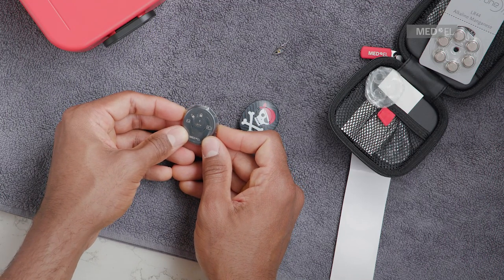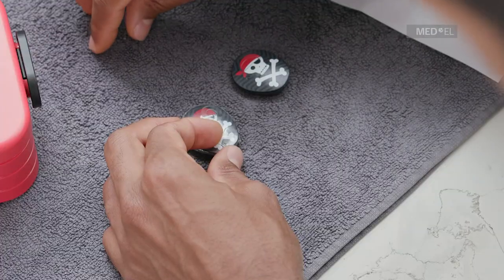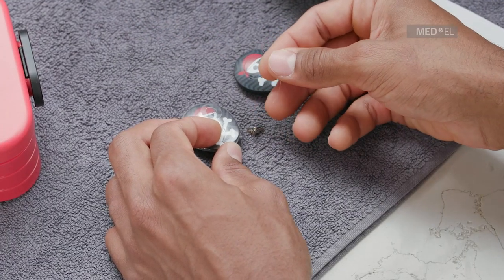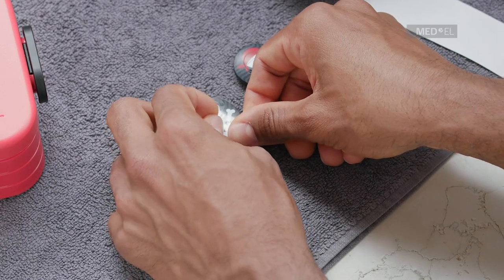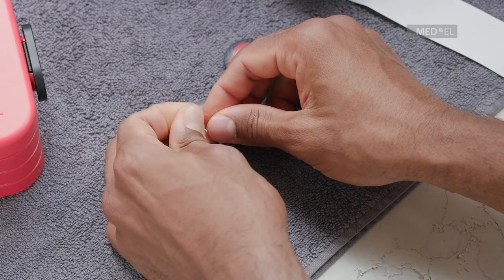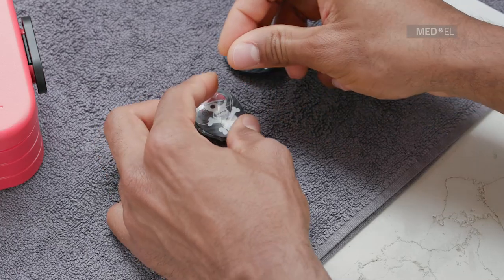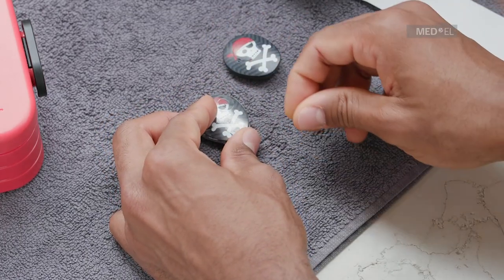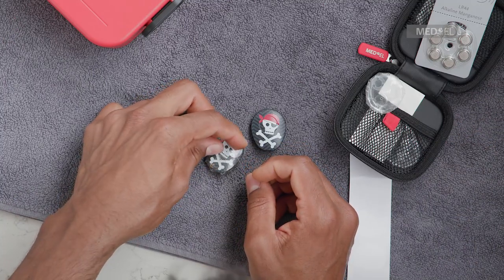To avoid losing the processor during activities, you should use additional fixation accessories such as the MED-EL sports headband or a swimming cap. To tie an attachment clip to Waterwear, use the semicircular flap at the top. Pull the loop of the string through the hole of the semicircular flap and pull the end with the attachment clip through the loop. Your Samba 2 with Waterwear is now ready to use.